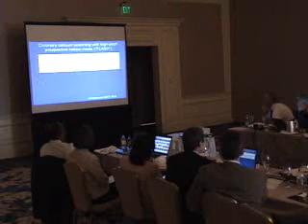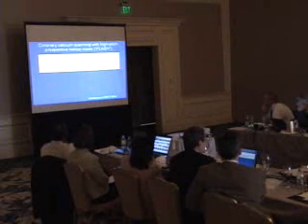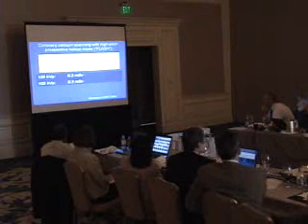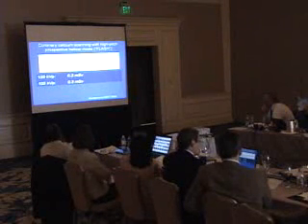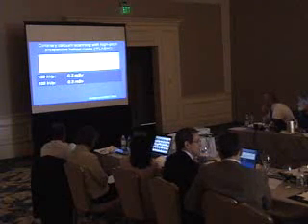I guess finally, just to give you some very recent data, looking at high-speed, high-pitched helical scanning with the flash system. That was the one that I showed you that got the information in a single beat.